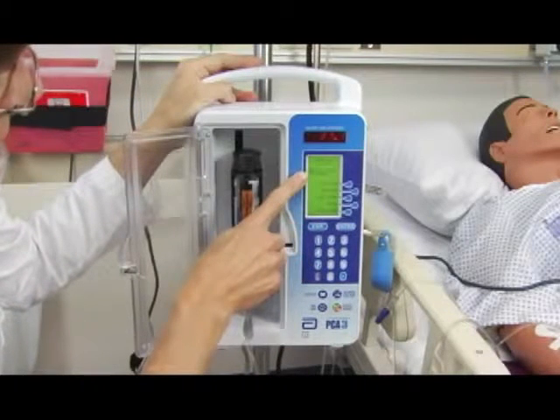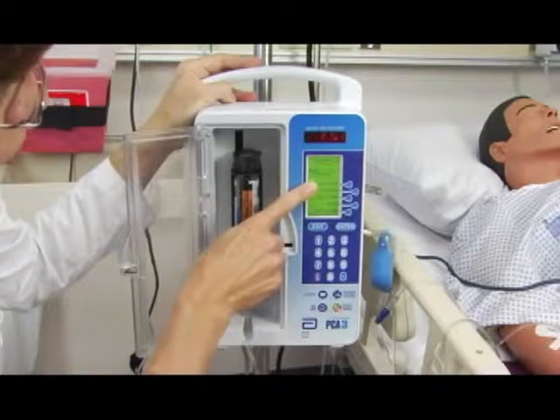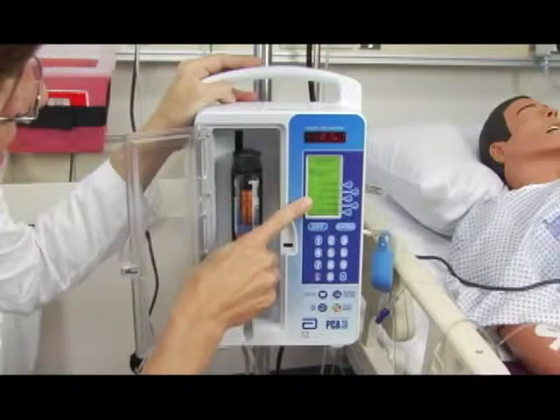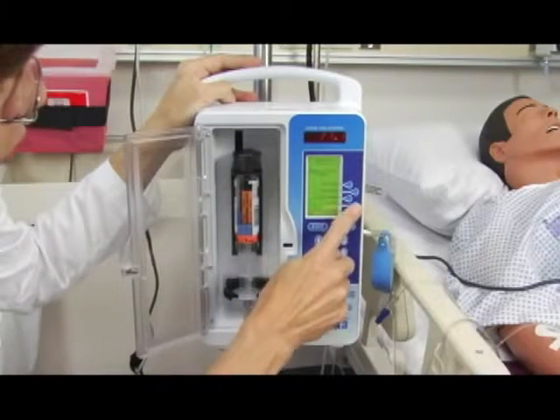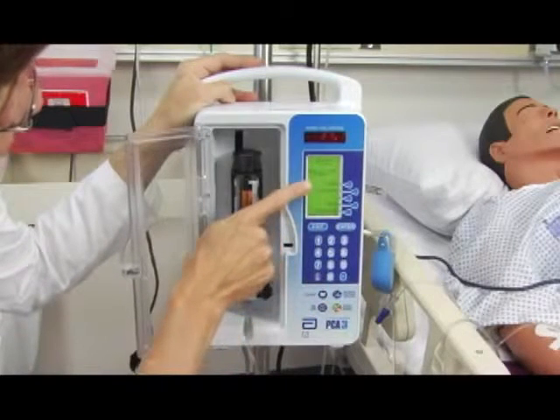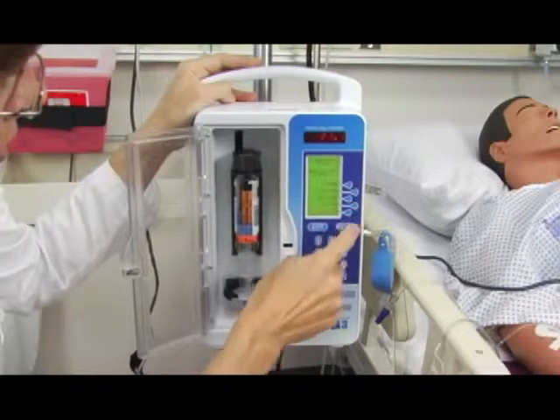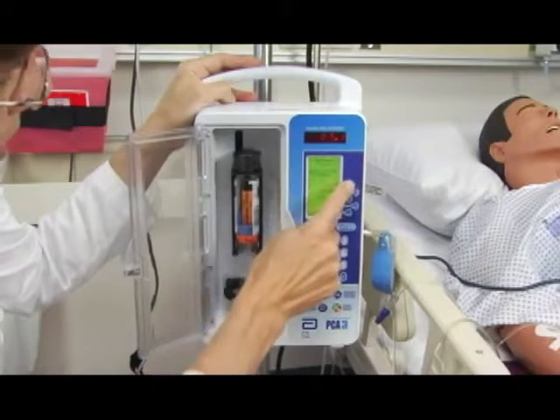It allows you to select the setting that you would like to change. You can change your PCA dose, your lockout interval, your continuous rate. You can press this soft key for more options. You can change your mode. You can change your dose limit. So let's go ahead and talk about changing our PCA dose.